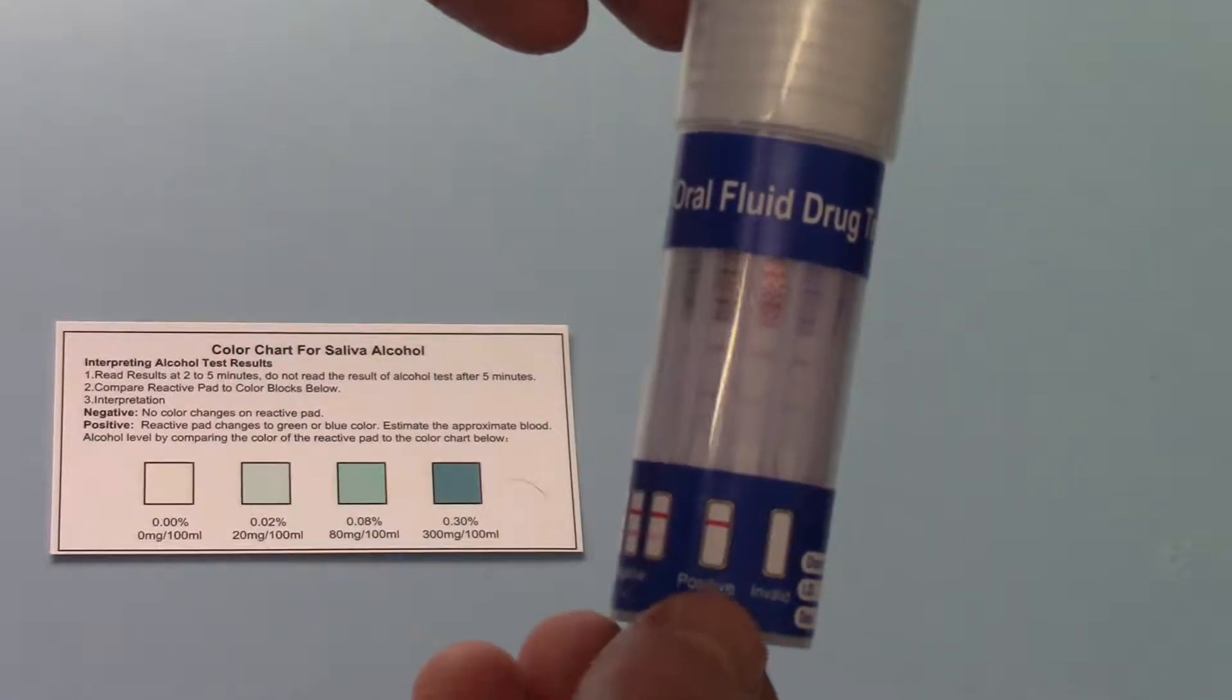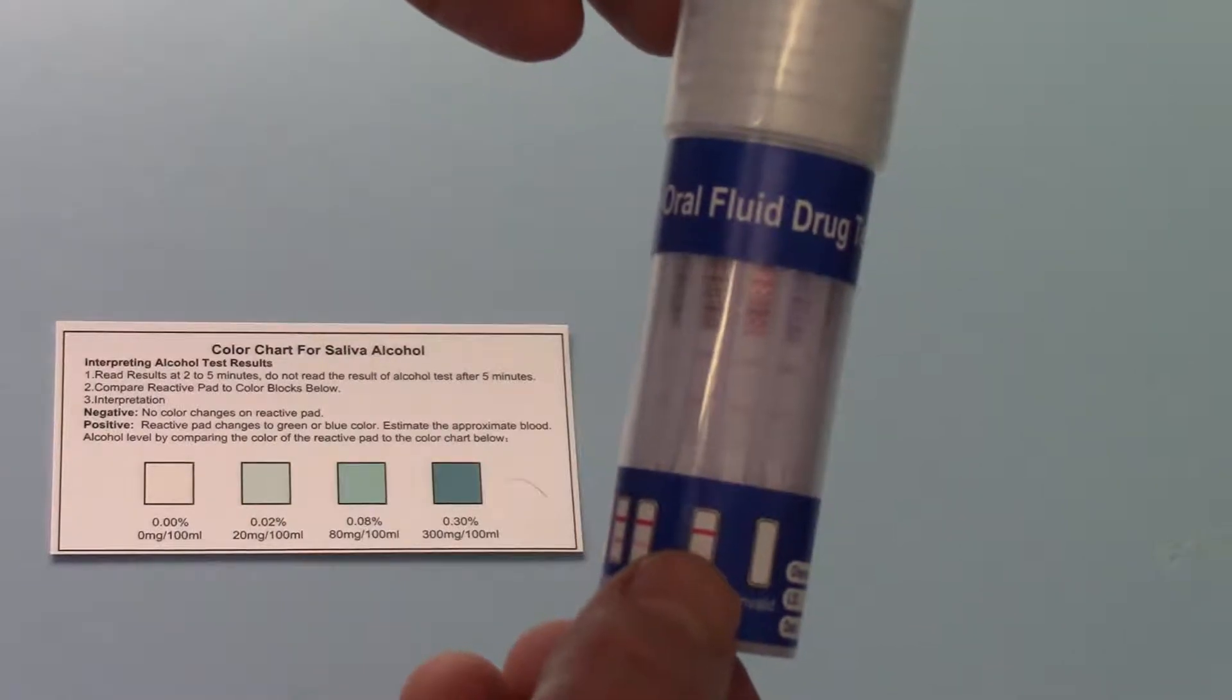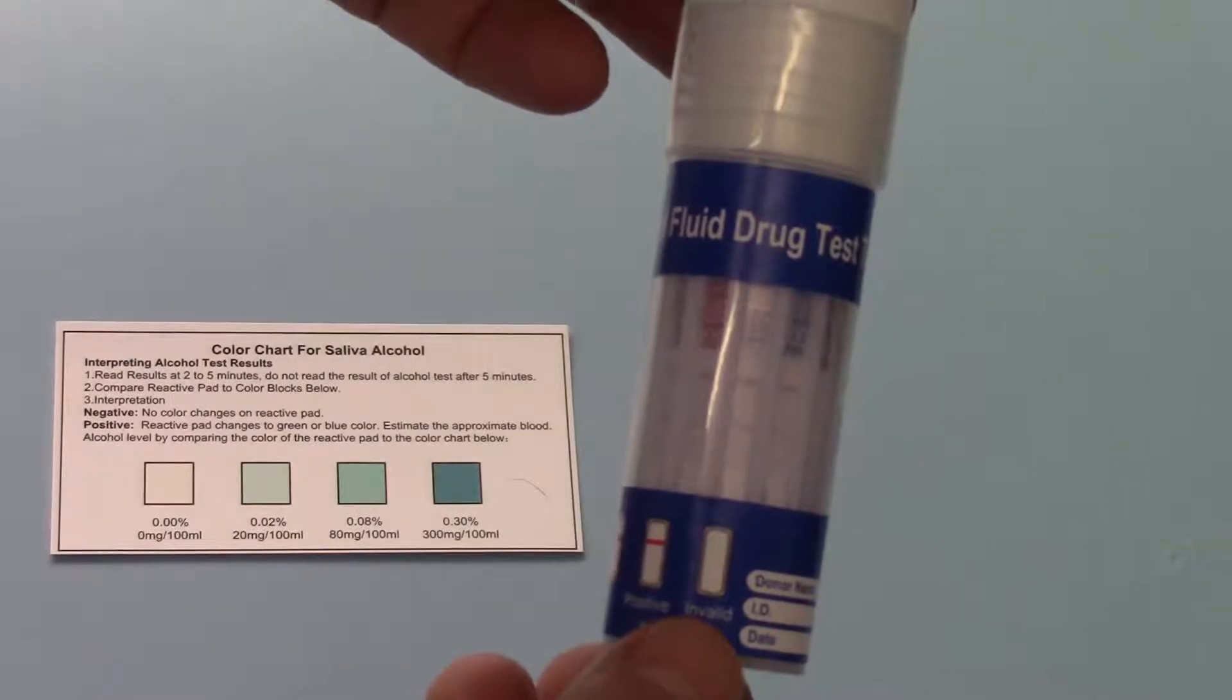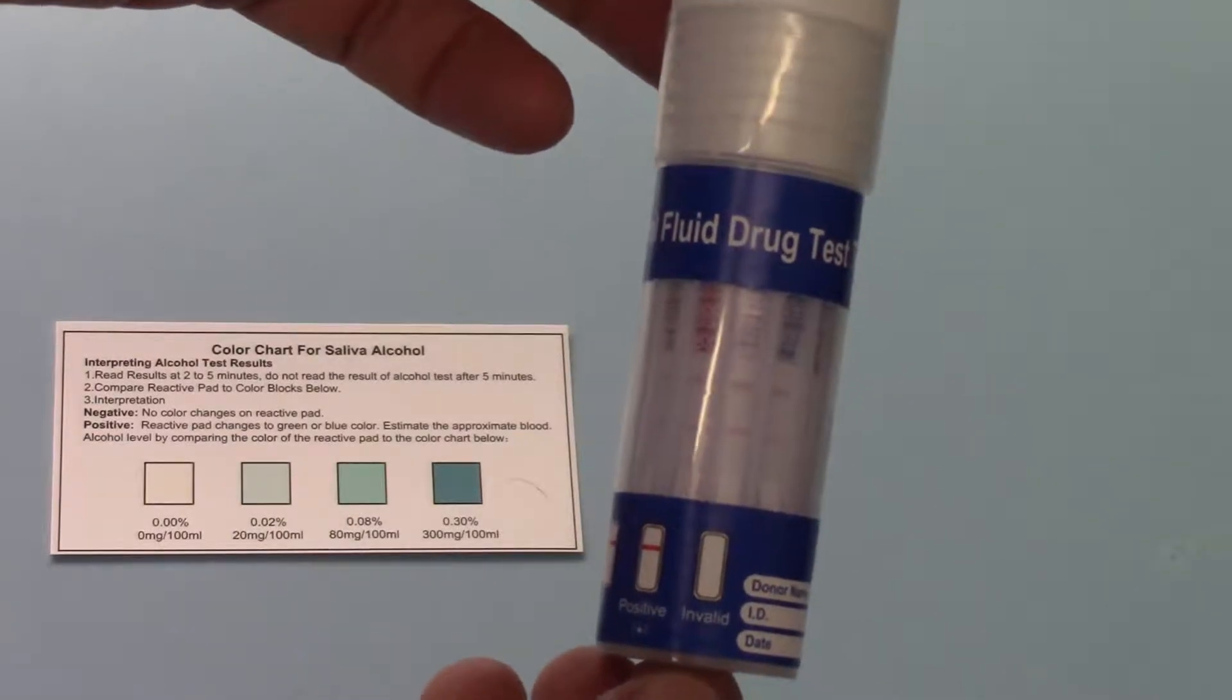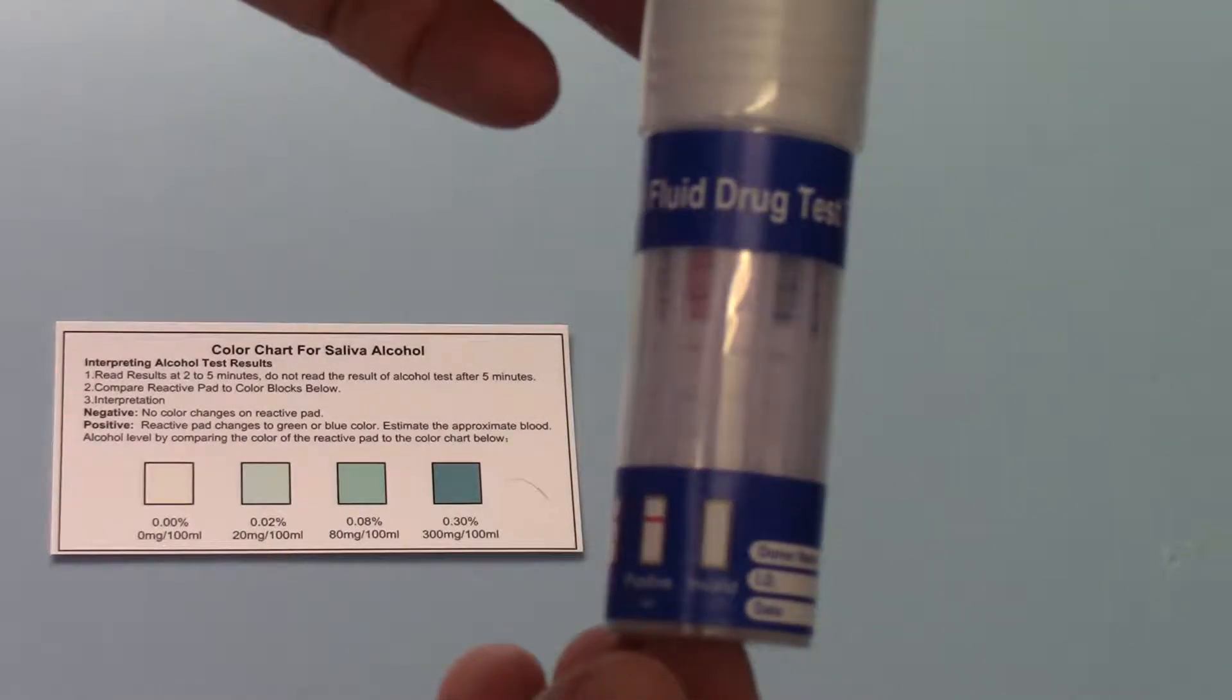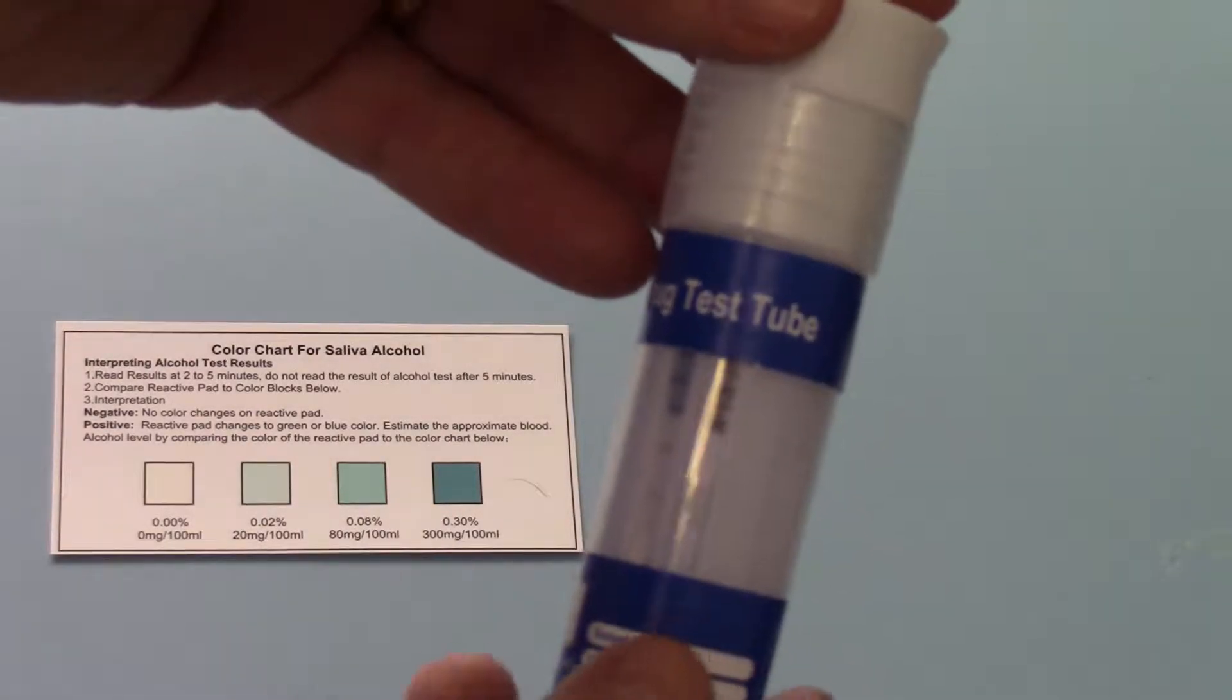It also gives you an indication of a positive drug test result where there is only a control line showing and no test line. An invalid test is where there's no control or test line, that would tend to indicate insufficient saliva has been added to wet that membrane and run it properly. And then on the very end you've got the alcohol pad.